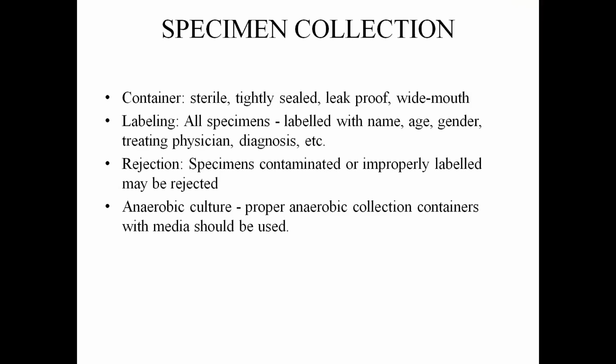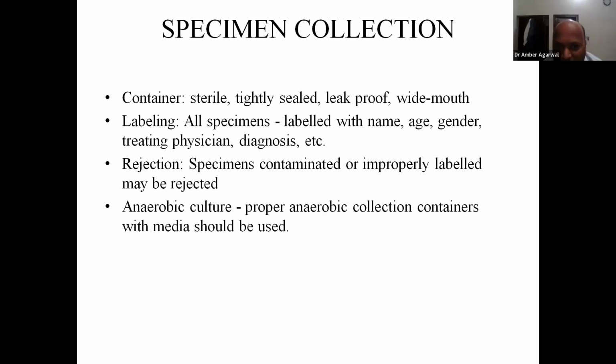But if in the mouth cavity you are thinking to send for an anaerobic infection, I have not received any sample till now, because we don't do the anaerobic infections in our lab. For anaerobic infection, if you just give a sample of the swab, I think it would be rejected. And second, even after collecting, for example, if you have collected a deep abscess, you need to send it in a liquid media, Robertson cooked meat broth, to the concerned lab.